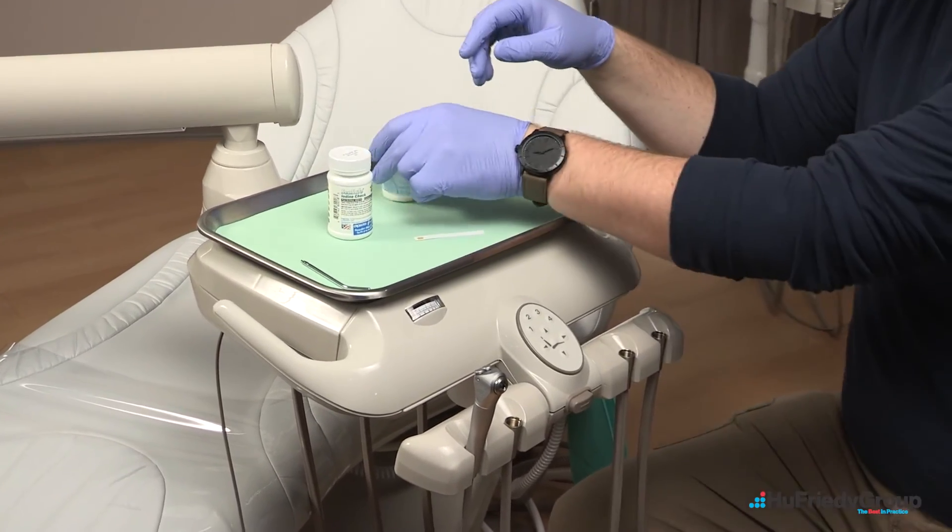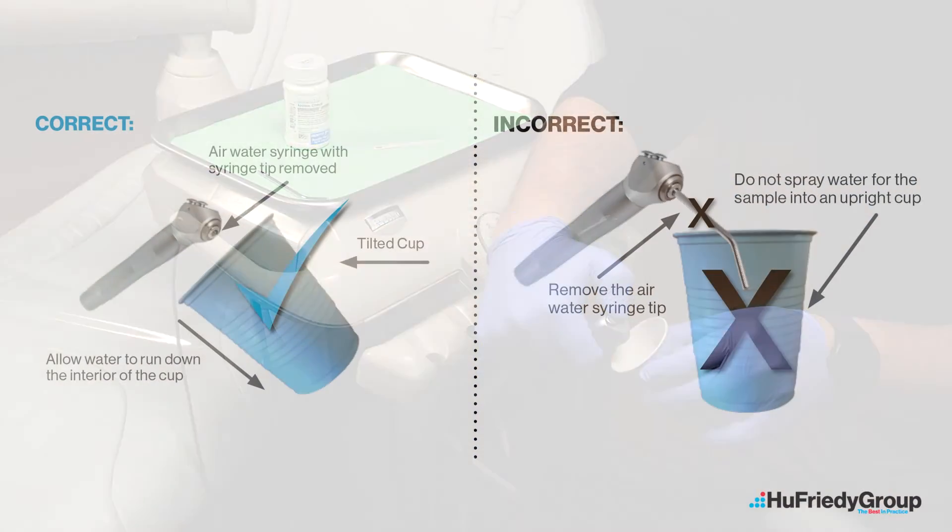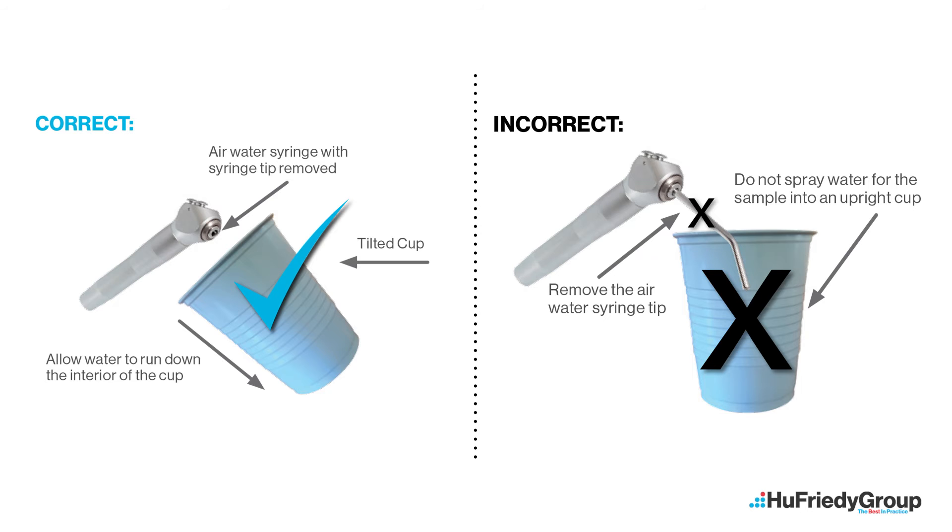Take a 20 milliliter sample by tilting the cup — a plastic dental cup is acceptable — and allowing the water to run continuously down the interior side of the cup to avoid turbulence of the water.